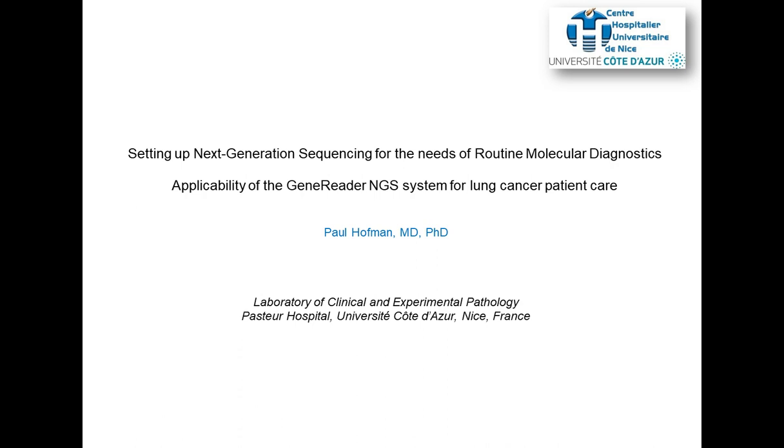No, I think I would say that it's now pivotal to set up an NGS system in any pathology laboratory or any molecular pathology laboratory all around the world. It's a critical step right now for our patients to have the possibility to get any mutation results or rearrangement results as soon as possible, I would say in less than 10 days when we get the biopsy in the laboratory. So thank you very much.